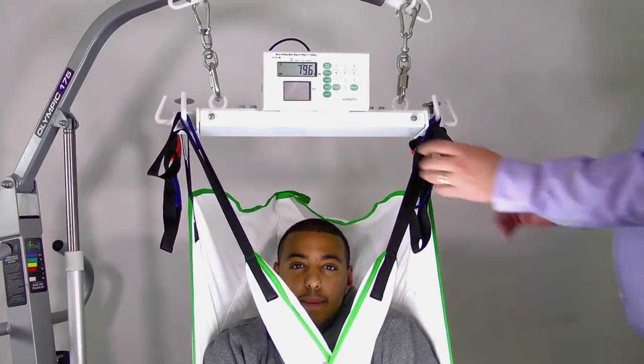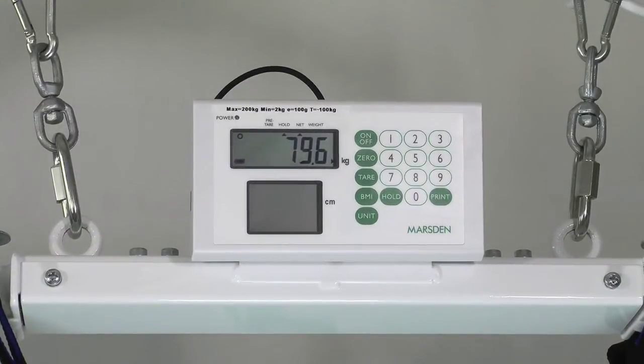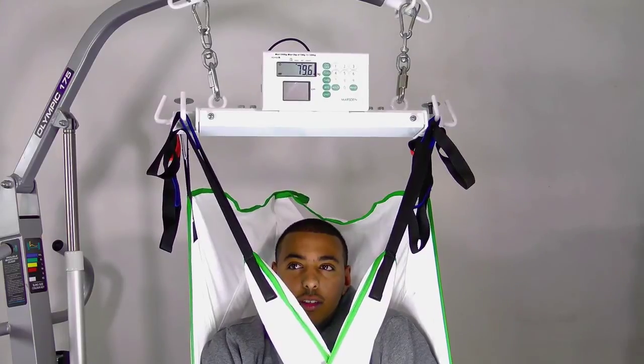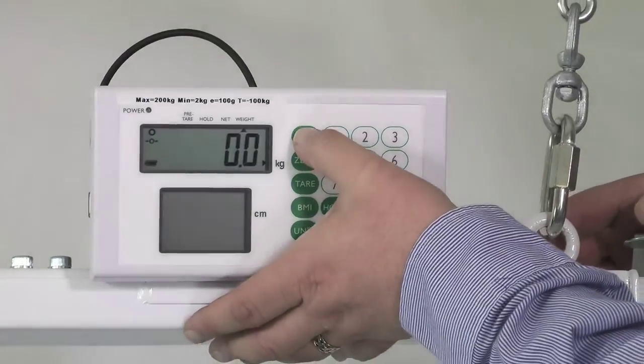Place the patient in the sling, then press the hold button to make sure you will get an accurate result, and lift the patient. Make sure there's nothing touching the patient, and once the weight is stabilized, the stable weight indicator will be shown on the screen. You can now take the weight from the scale display. When you're done, safely lower the patient and switch off the scale.